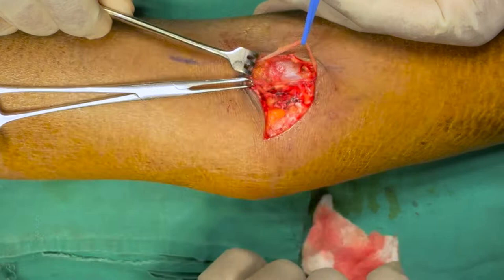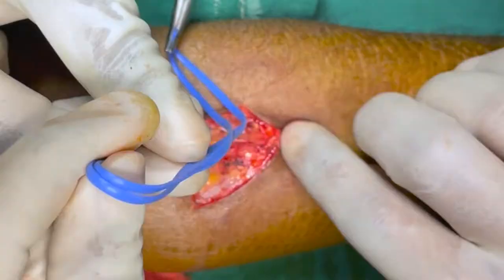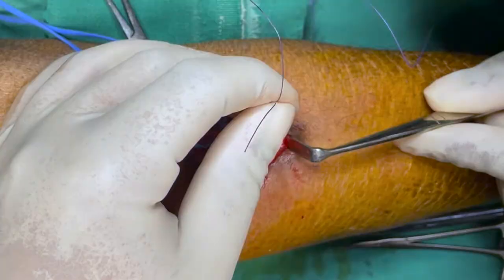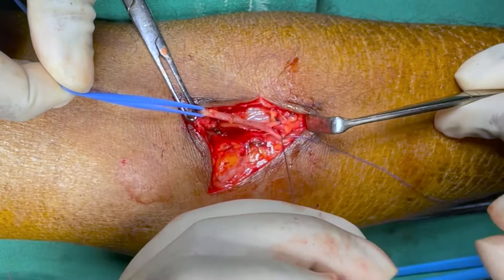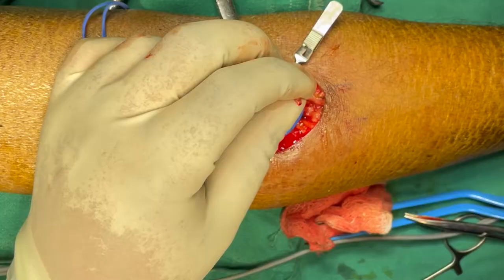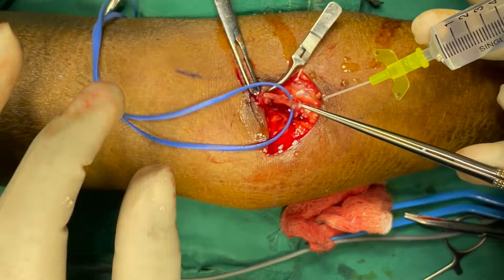Then the vein is mobilized proximally. Once we have adequate length, ligate the distal end and divide. Now look for the patency of the vein by injecting heparinized saline.